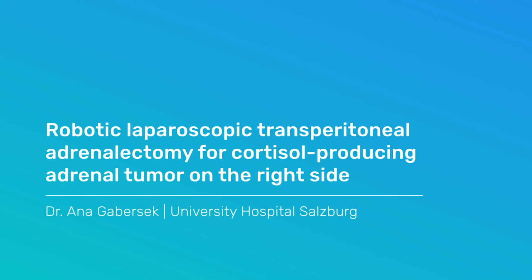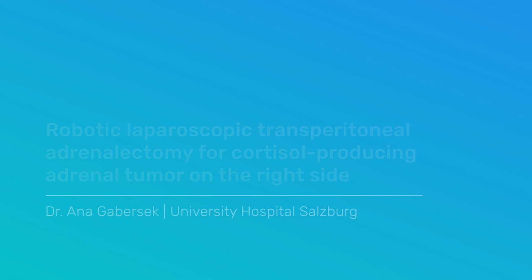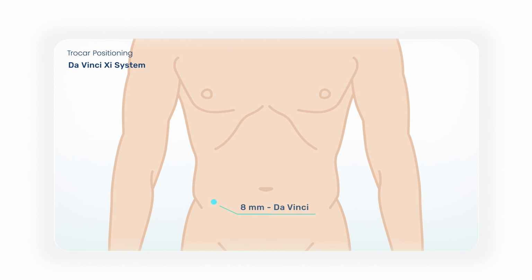Robotically assisted laparoscopic transperitoneal adrenalectomy due to cortisol-producing tumor of the right adrenal gland. In this first schematic picture, we can see the positioning of the trocars.